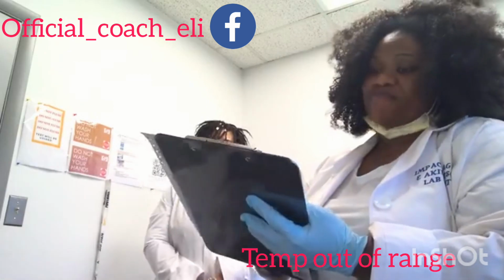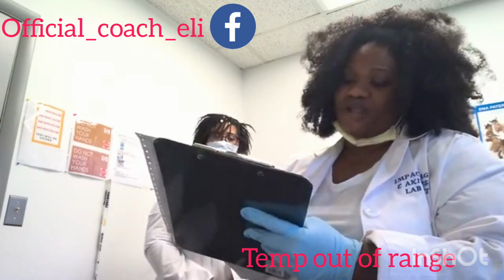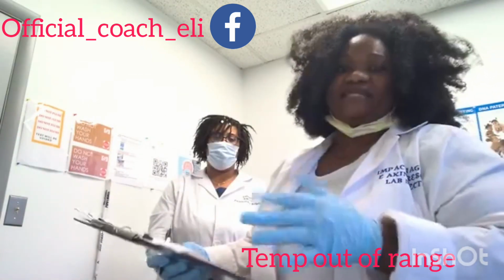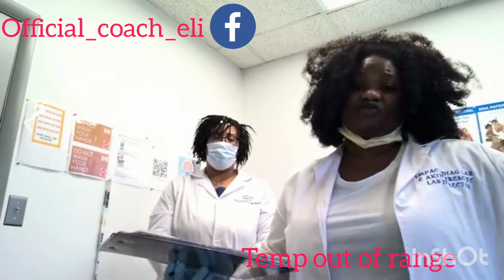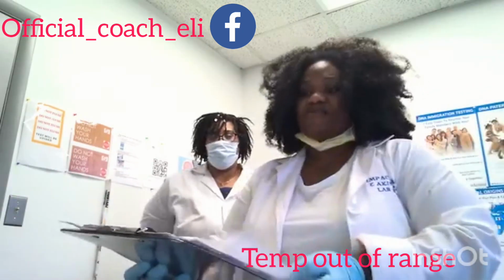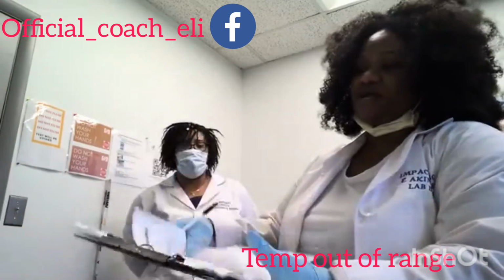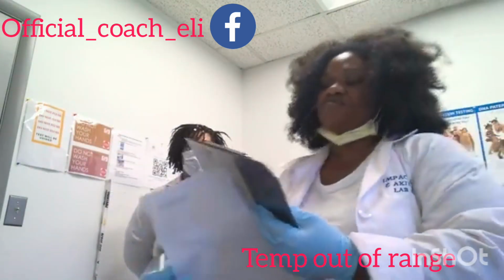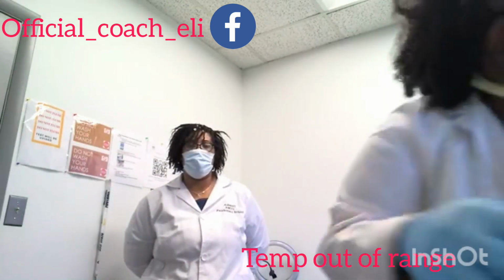All right, in my remarks section, I'm going to then put temp out of range test 1 of 2, and by default I'm going to have to go back and grab another, because I'm doing another 2 test, right? I'm going to get the second CCF form, and I'm going to cross-reference the specimen ID number, and I'm going to put it in my remarks section. All right, 1 of 2. Then let's finish this test, because we have to finish this test.